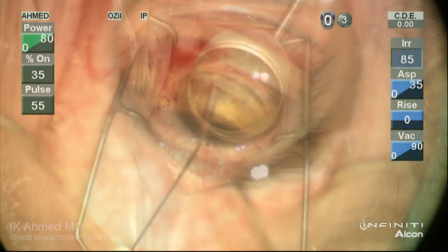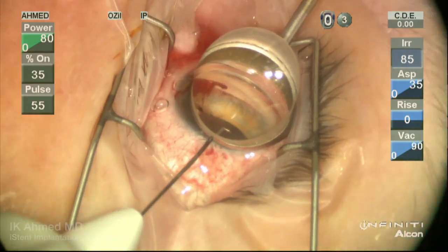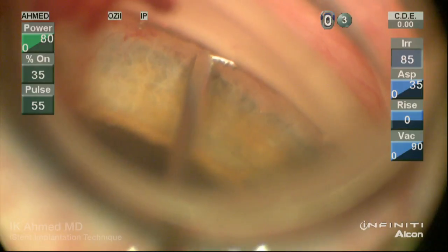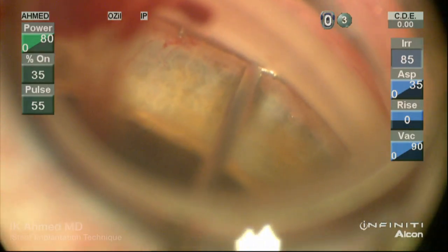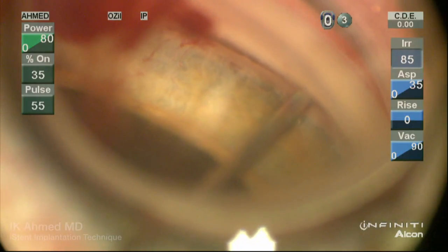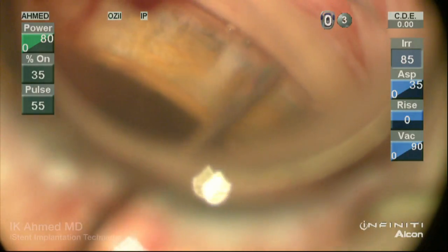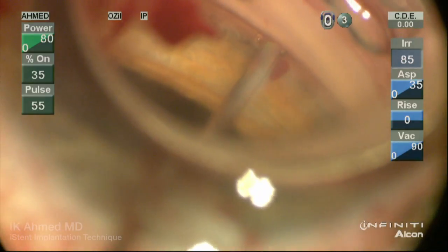A syringe is used to help visualization and move the blood away from the area of interest. Our third iStent is being placed, again entering at a 30-degree angle. Once a third of the device is inside the canal, straighten the hand out, pull toward the incision slightly, and allow for smooth passage within the canal. It's important that the eye moves very little to ensure we're not torquing the eye and hitting the outer wall during implantation.